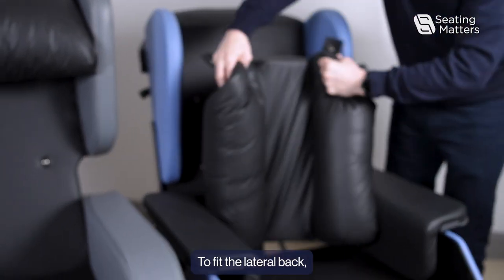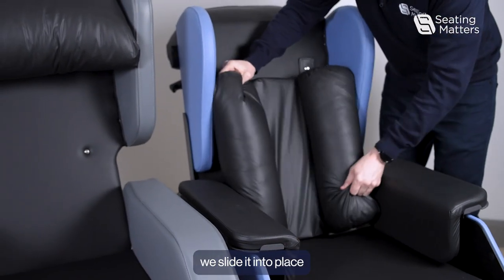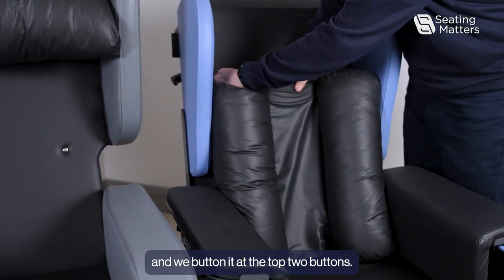To fit the lateral back, we slide it into place and button it at the top two buttons.